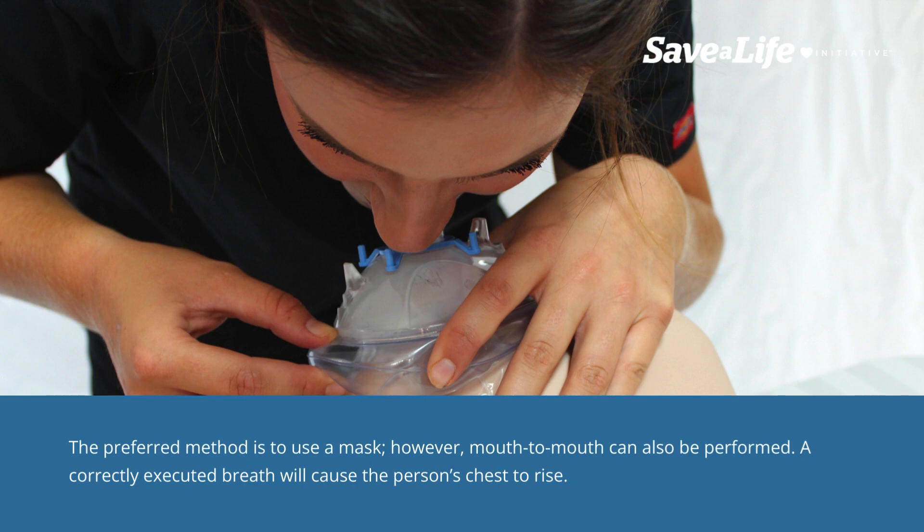The preferred method is to use a mask. However, mouth-to-mouth can also be performed. A correctly executed breath will cause the person's chest to rise.